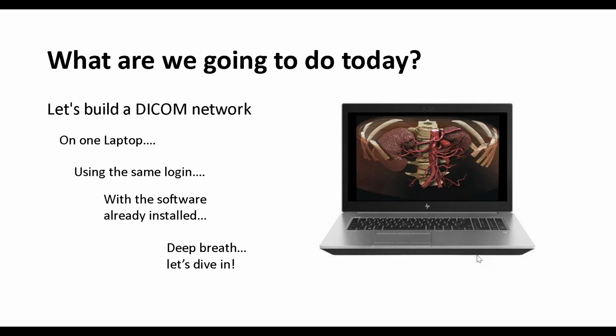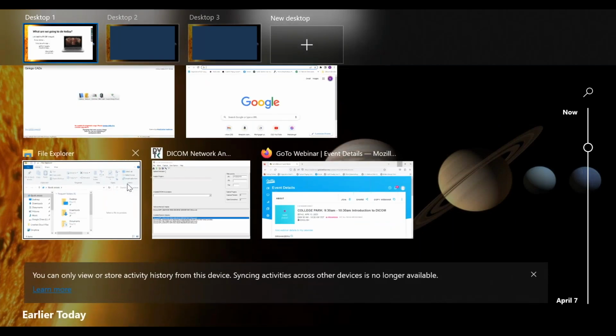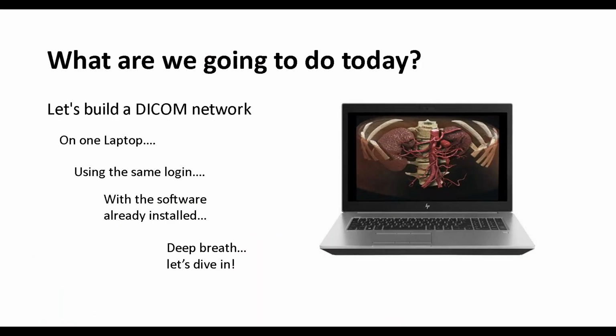So the big question is, well, why is that going to work? Well, I don't have to worry about a firewall because I'm not really leaving the machine. But should it still work? Can I run a user, an SCU and an SCP on the same machine? Well, yeah, actually, I'm sort of doing it right there. Okay, so let's take a look at this. First thing I want to do is I want to get, well, actually, I jumped ahead a little bit. Deep breath, dive in. Boy, I was already off the board, wasn't I?